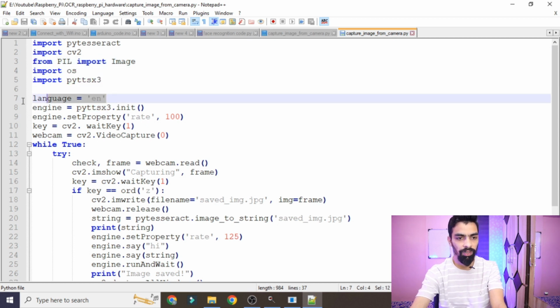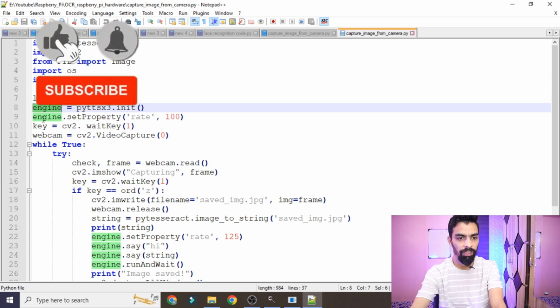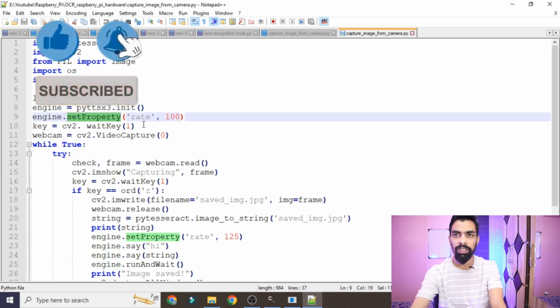First we define the language as English, then we define one object which is used for the text to speech library. Here we define that object. You can see engine is the object and this is the library. To access that library's functions we need to define that object. Then we define some properties, that is the speak rate.